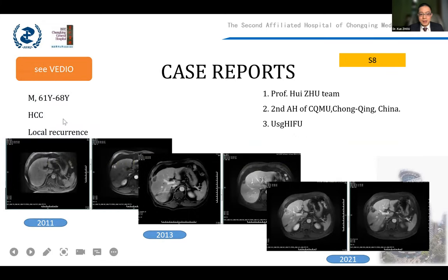Well, the next case, I'd like to share some video with you. We see this patient had nothing in 2011. And in 2013, a small HCC happened in segment 8. With the first HIFU ablation, it was a successful CR response. But unfortunately, this year we found a newly grown tumor here again, and we ablated it completely.